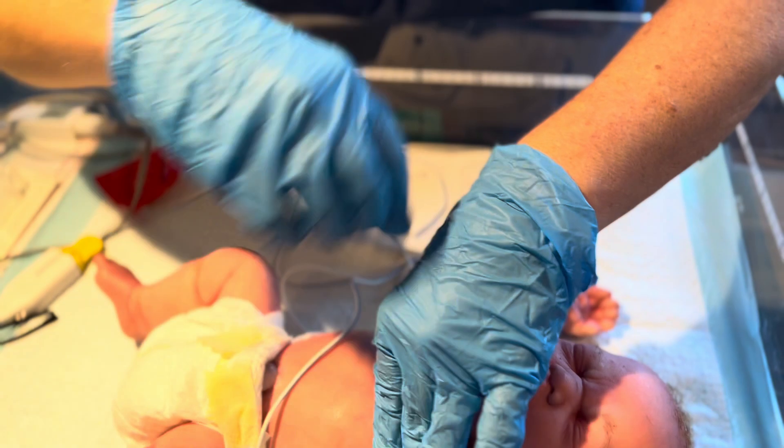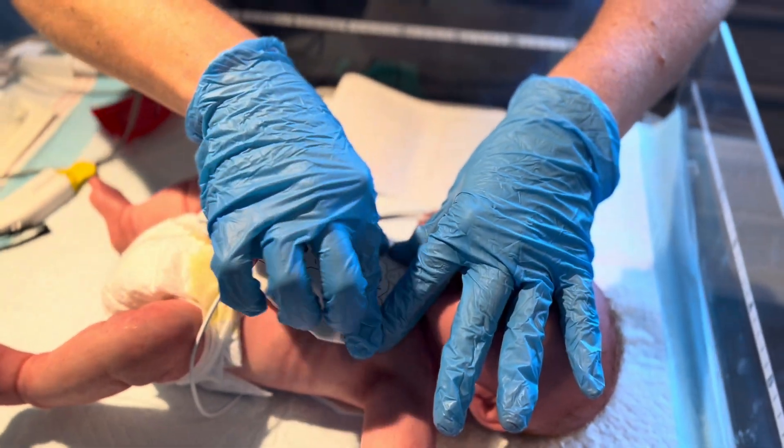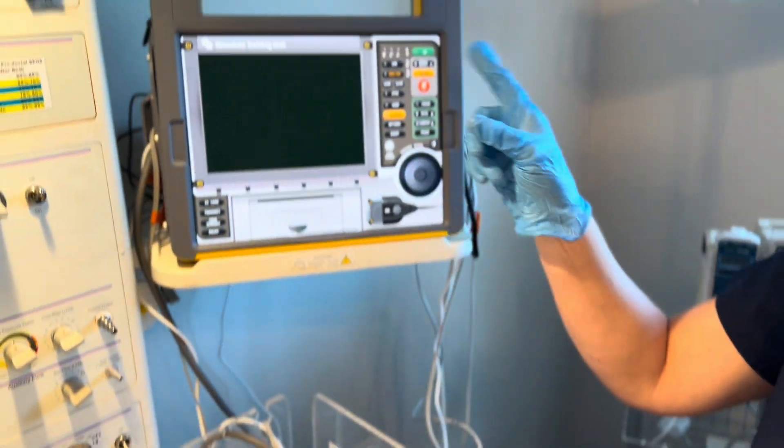Roll the patient back. Now, for anterior placement, you're going to place it on the front of the patient, and at this point it's time to power on your defibrillator.